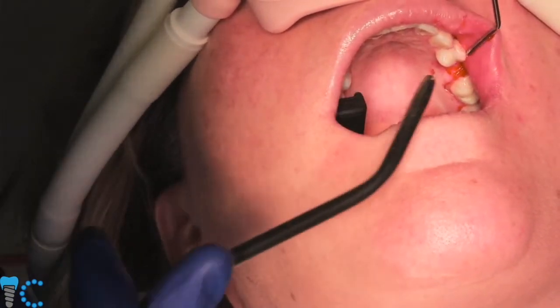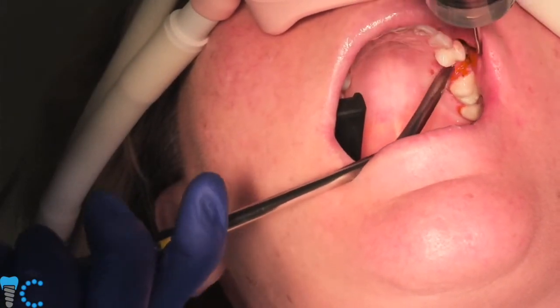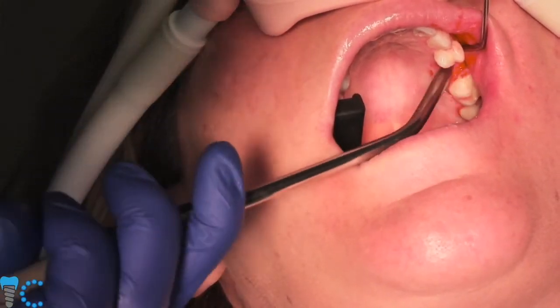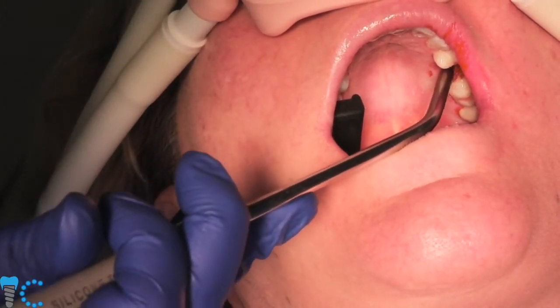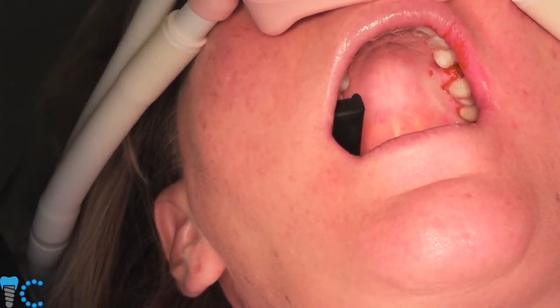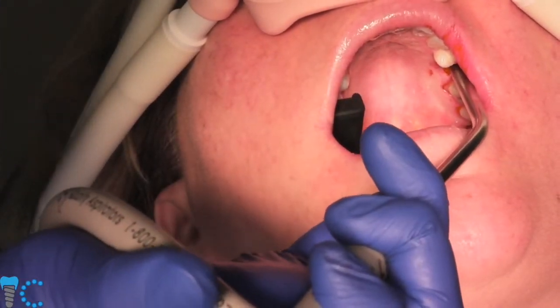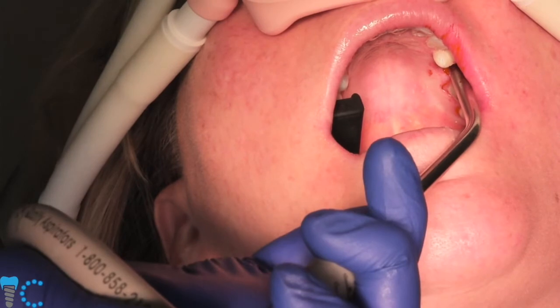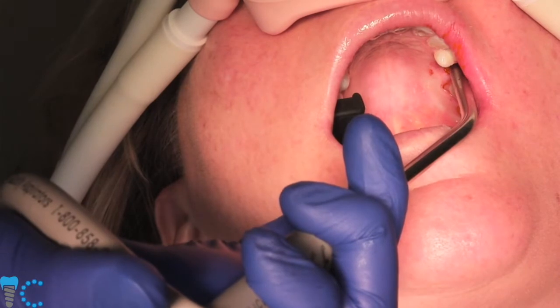So we've used the countersink. There's a little bit of creativity in using the countersink here. We're not going to use it a whole lot. It depends a little bit on what the ridge form looks like. If they've lost a lot of ridge height, then there's not a lot of need for the countersink. So what we're going to do now, we've gone through the 3 twist drills, gone through the countersink, and now I'm going to change the speed on my implant handpiece from 800 RPMs down to 20.